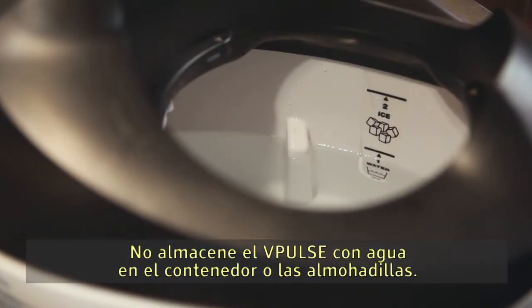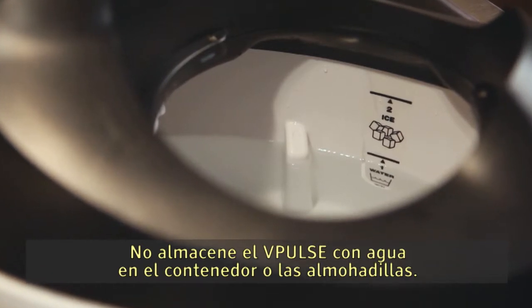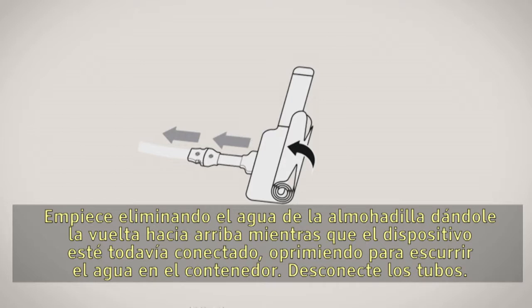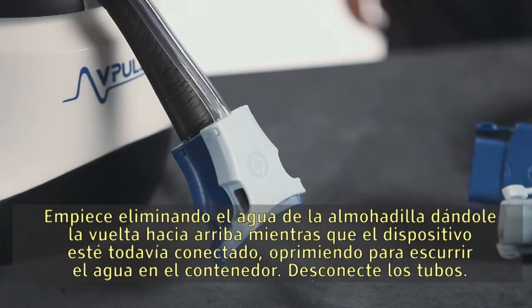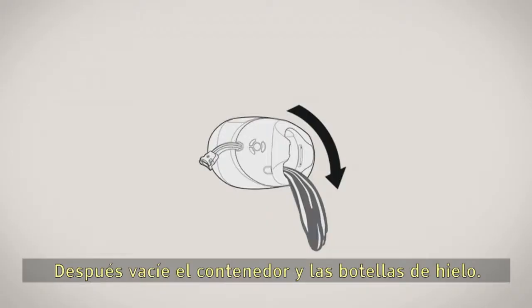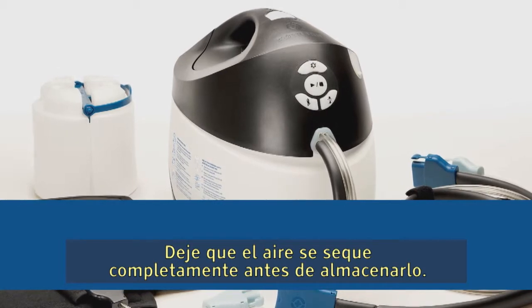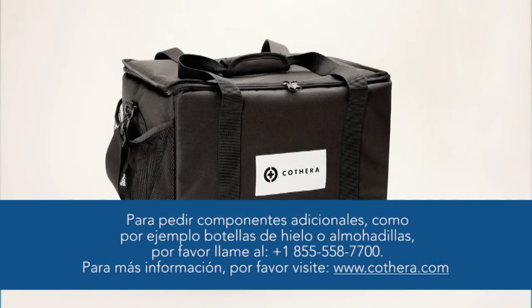Do not store the V-Pulse with water in the container or the pads. Begin by removing water from the pad by rolling the pad up while still connected, squeezing the water back into the container. Disconnect the hoses, then empty the container and ice bottles. Allow to air dry completely before storing.